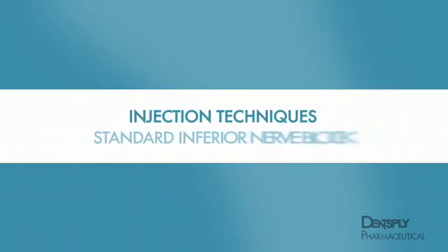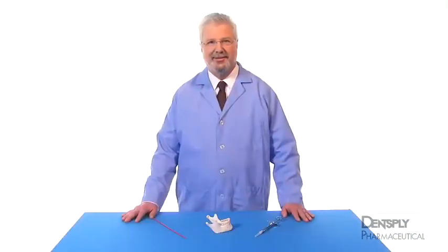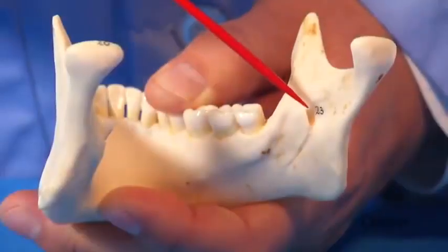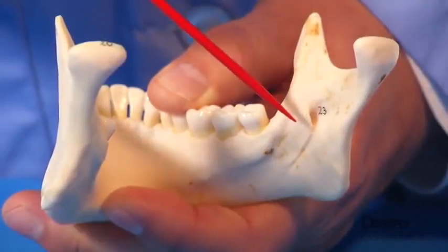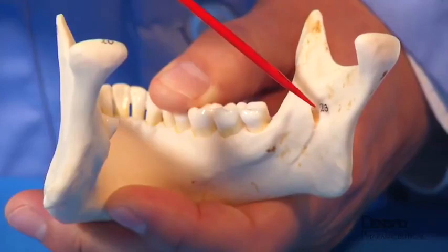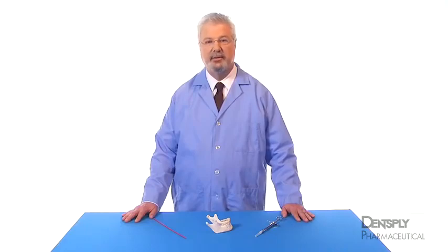Injection Techniques Part 1. A standard or classical inferior alveolar nerve block is used worldwide for producing mandibular anesthesia. The target for the inferior alveolar nerve block is the mandibular sulcus, just superior to the mandibular foramen and behind the lingula, a bony prominence on the ramus that anchors the anterior attachment of the sphenomandibular ligament.